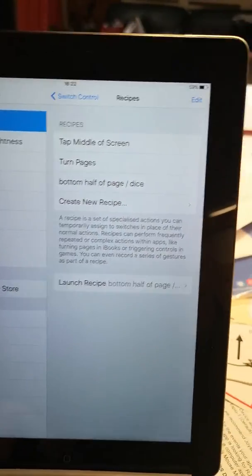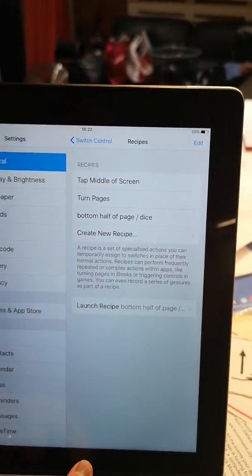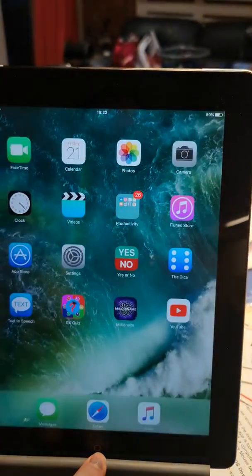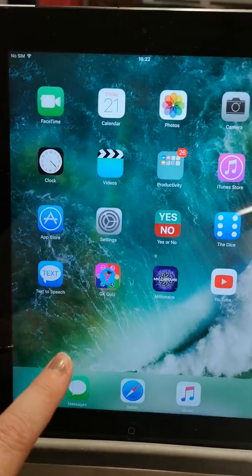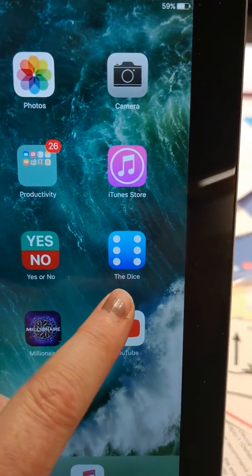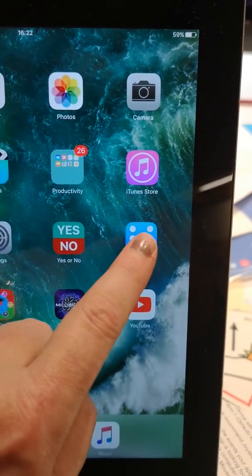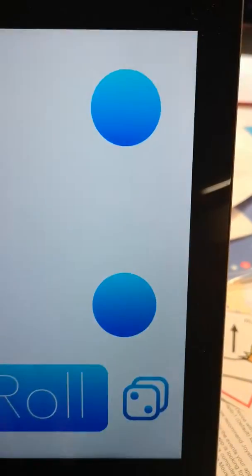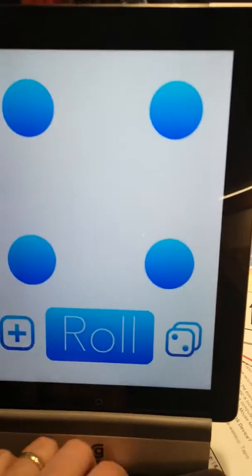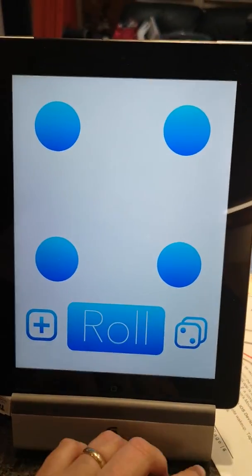And I will show you why. Because I downloaded this app called the Dice. Which we're going to. And there it is.